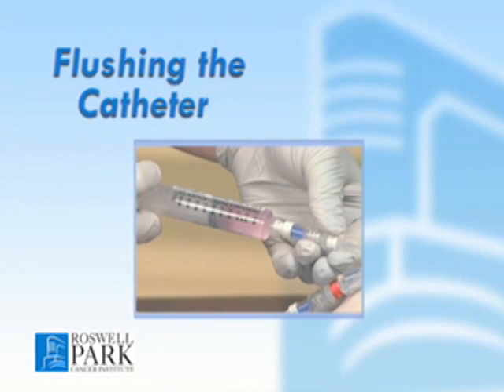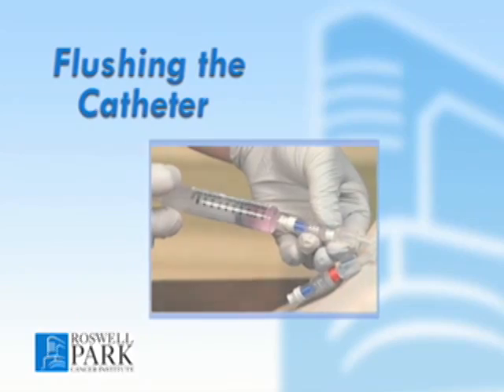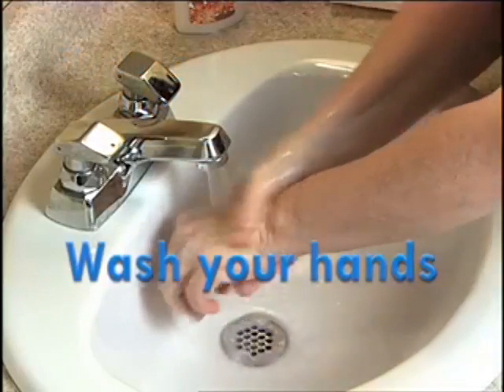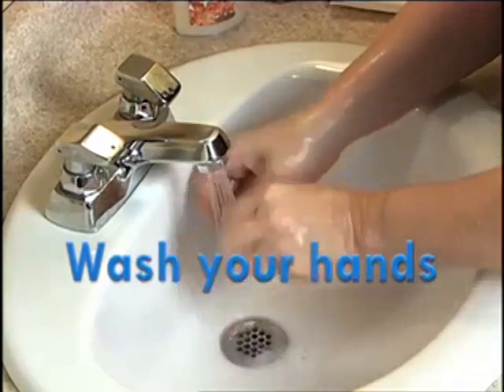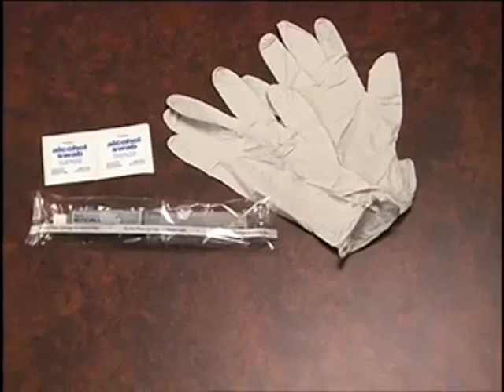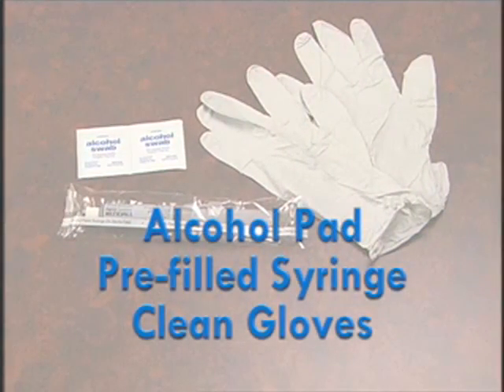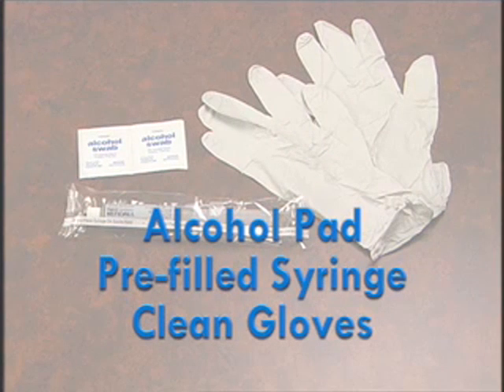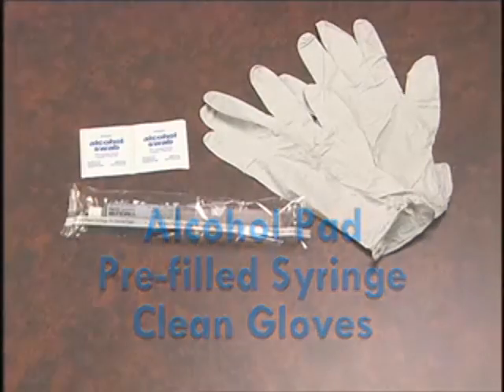Flushing the catheter is important to maintain the line and prevent blood clotting. As always, before caring for your line, thoroughly wash and dry your hands. Gather the supplies and assemble them in a clean work area. You will need alcohol pad, syringe pre-filled with the solution that was provided to you, clean gloves.